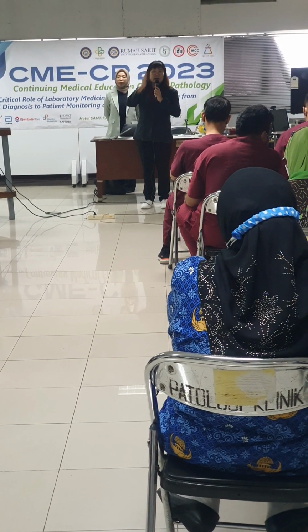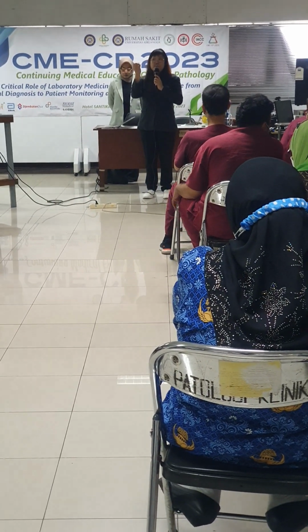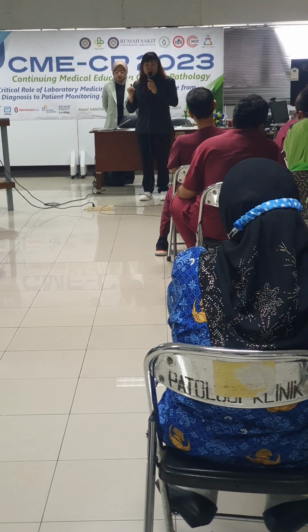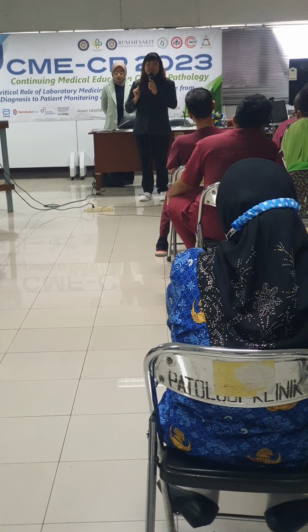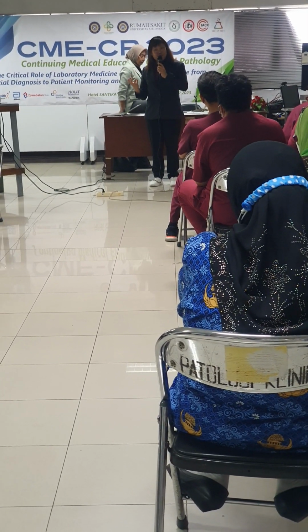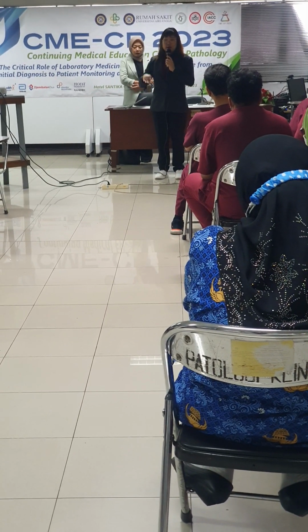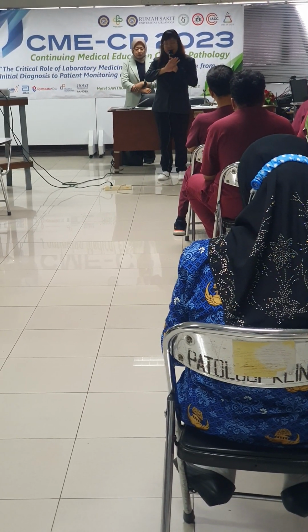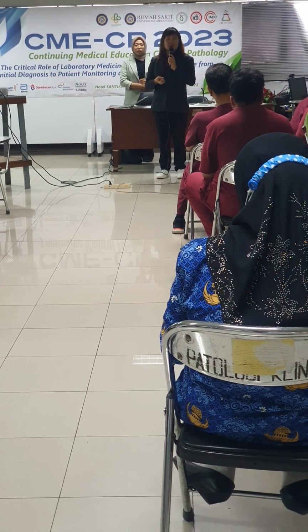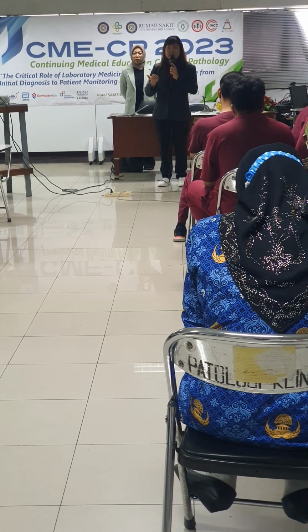And whether you can do it extraction free or not extraction free with open protocol, it depends on your subsequent R&D. So maybe to begin, to make it easier, we can talk about extraction first. And after that, we try it without the extraction. So all this is the only one that I know so far that has this possibility. Okay, I answered the first question and the second question.